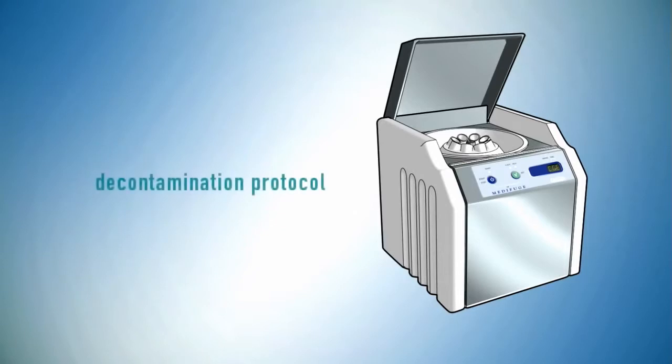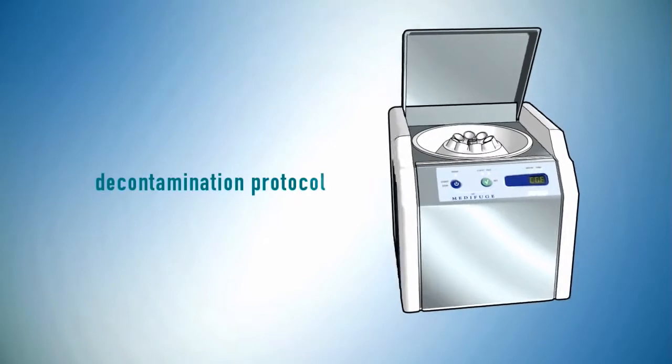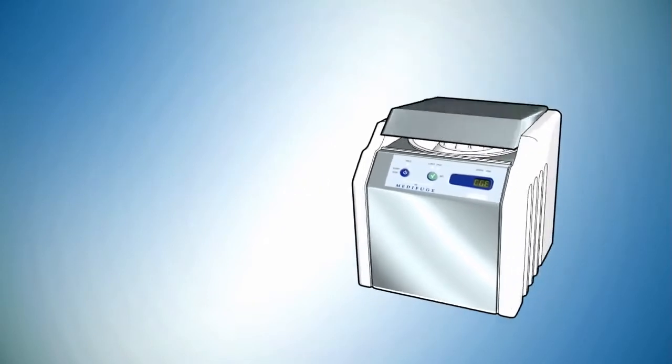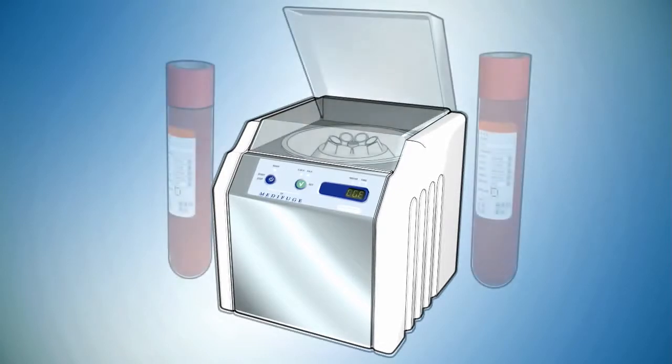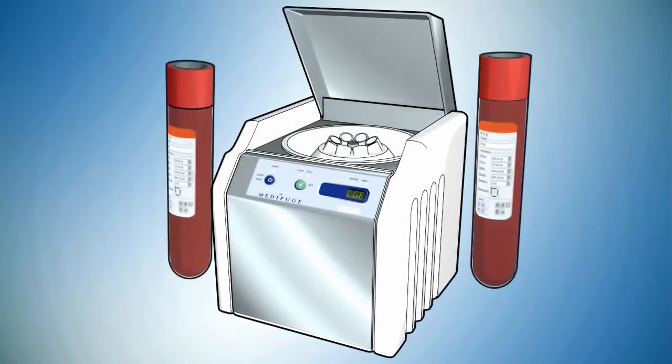Medifuge setting: phase separator. Decontaminate the machine through the appropriate protocol, then set up the program mode CGF. Put in the test tubes with blood within two minutes of the execution of the first drawn blood.